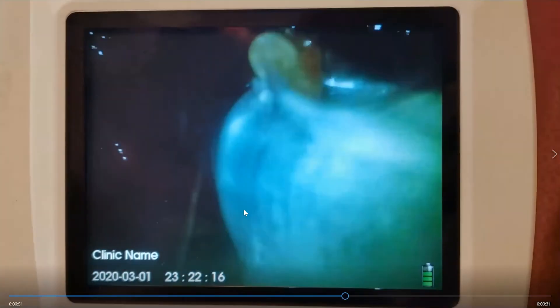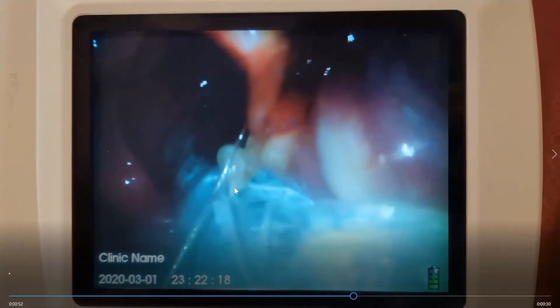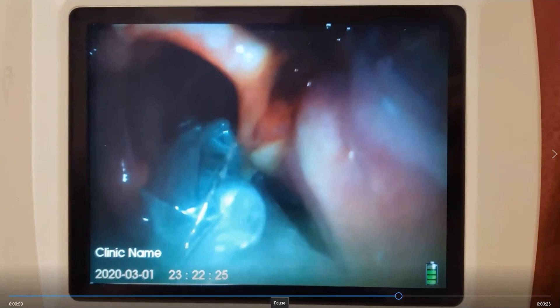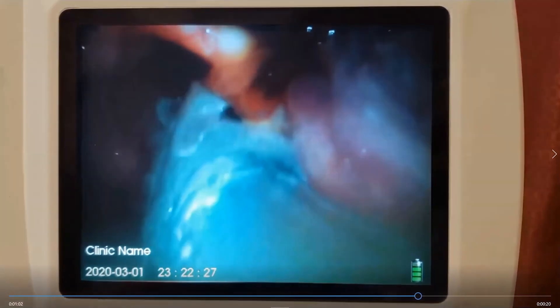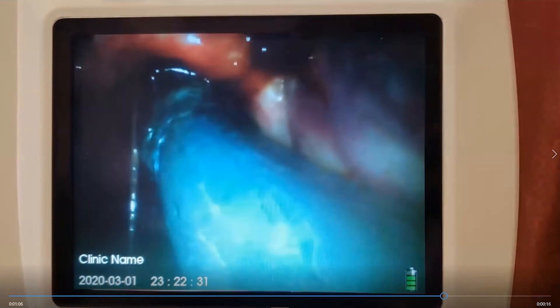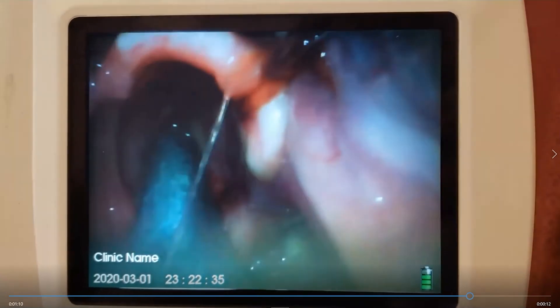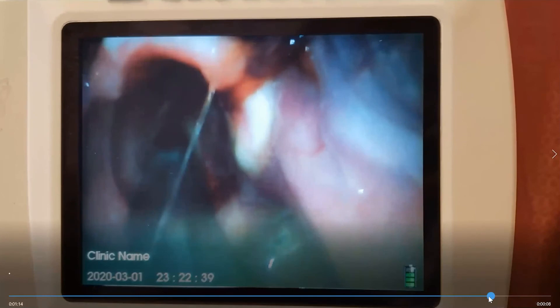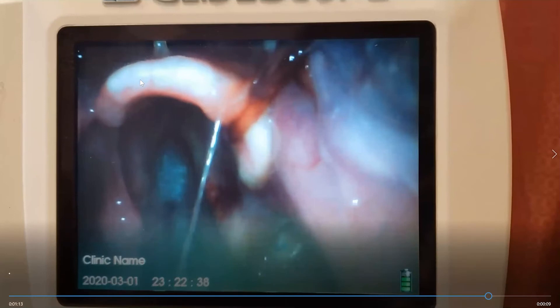The endotracheal tube is coming in. Notice the endotracheal cuff — we want this past the cords. But notice the tube is curved and as we advance, we begin to hit the anterior portion of the trachea. I pause and tell my assistant to pull back the rigid stylet just a little bit, then I slide the tube off. You can see the cuff pass through the vocal cords right there. Looking back, you can clearly see the vallecula, the epiglottis, the false vocal cords, and the endotracheal tube through the glottic opening — the cuff is no longer visible, so we're in good position.